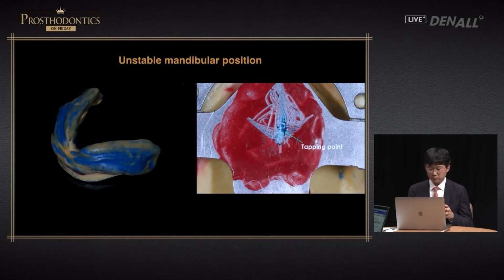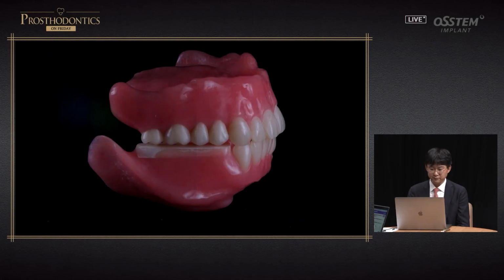In this patient, even after achieving the occlusal stability, if you fabricate a denture all at once, actually, if you take tissue condition impression, it can reduce the internal pain quite considerably. So this is performed with 2 purposes. There are 2 purposes of using treatment denture in this patient. First, stable occlusion. Next, checking chewing position and painless status is used for tissue conditioning to reproduce the inside.